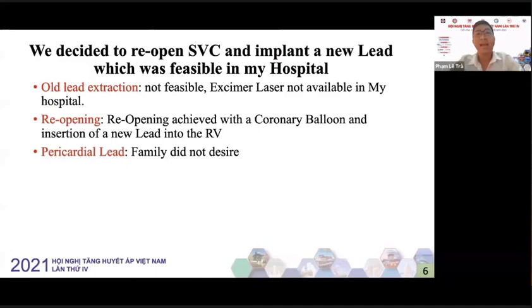We decided to reopen the SVC and implant a new lead, which was feasible in my hospital. Old lead extraction was not feasible. The excimer laser system is not available in my hospital. Reopening was achieved with a coronary balloon and insertion of a new lead into the RV.